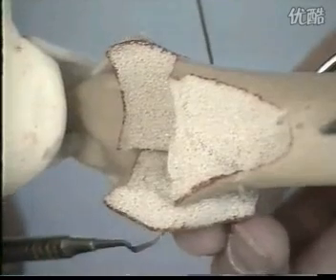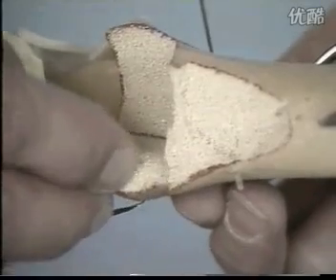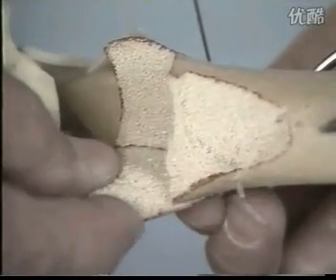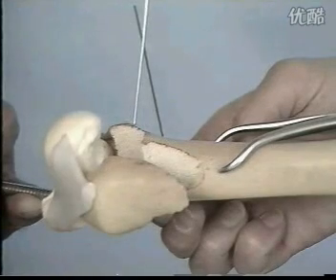Dorsal reduction is performed with a small sharp hook. In the following steps, we use the talus as an abutment. The fragment is fixed with an AP Kirschner wire.